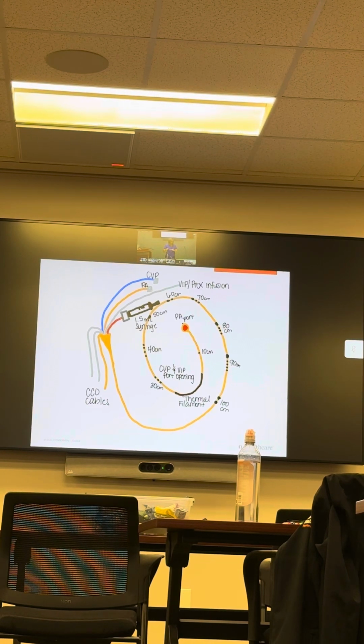So, because we can manipulate this within a patient, there is risk that it could move. So every time we ambulate the patient, they can absolutely walk with a swan, maybe don't do cartwheels, but they can ambulate with a swan, it's fine. Or we're giving and getting a report. We need to measure where it exits this hub, all right? And it is an estimate.